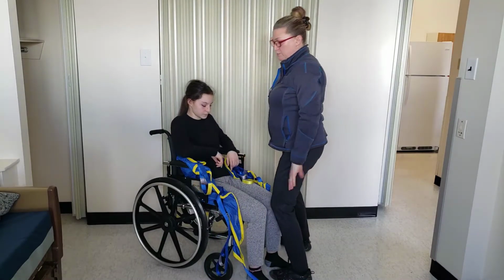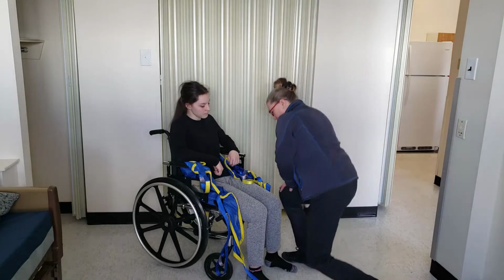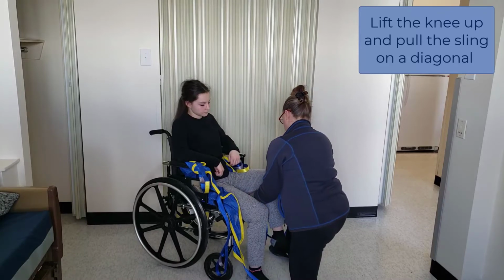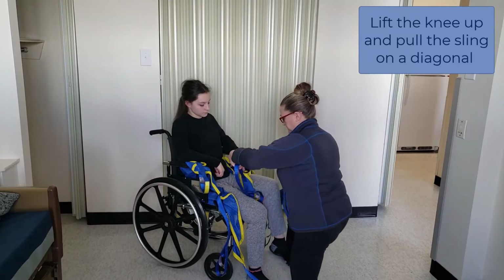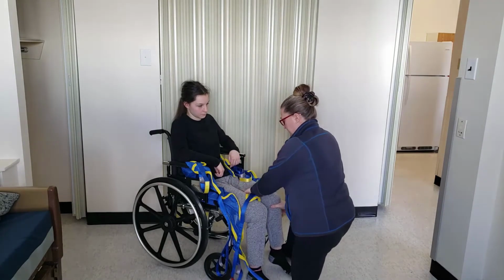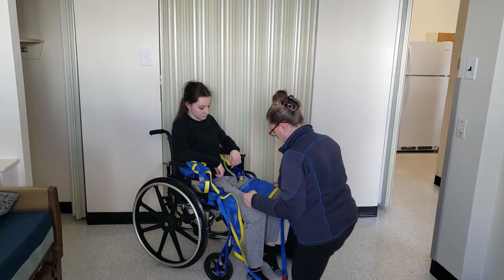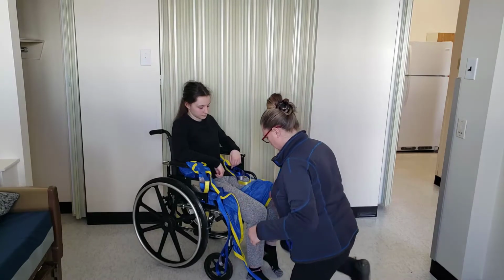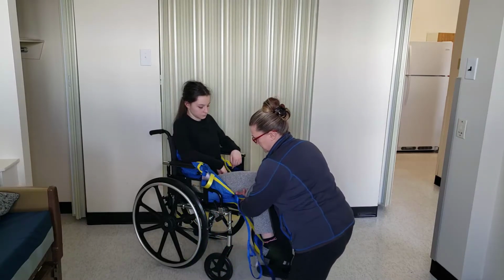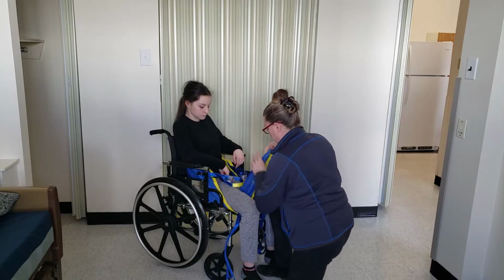You always want to keep in mind your body mechanics, as always. From here, I like to bring the sling under their leg. And if you lift their knee and pull the sling on a diagonal, it'll come under their buttocks and their leg a lot nicer. So you'll be in front of their one leg. So you place it underneath them, and then you're pushing their knee back, pull it on a diagonal.